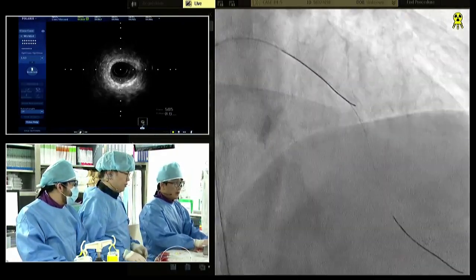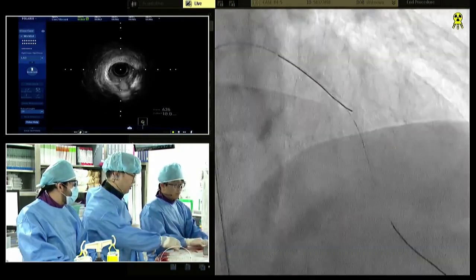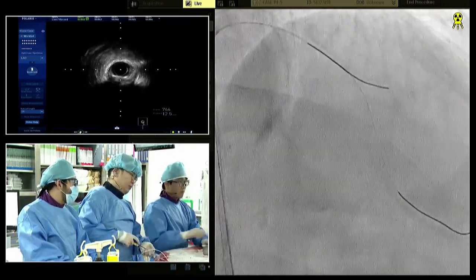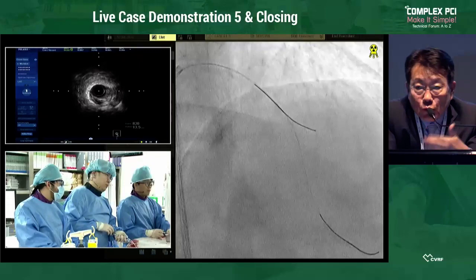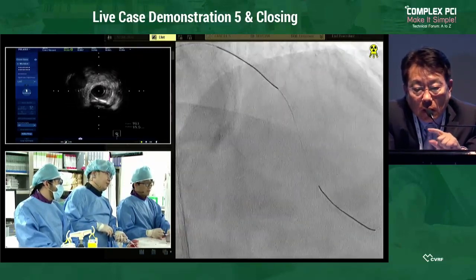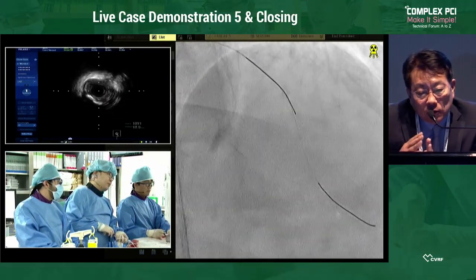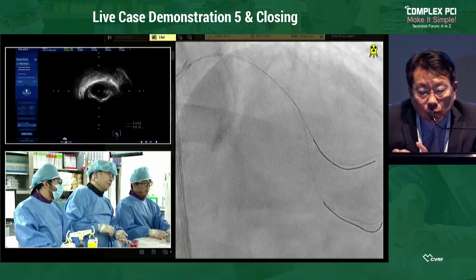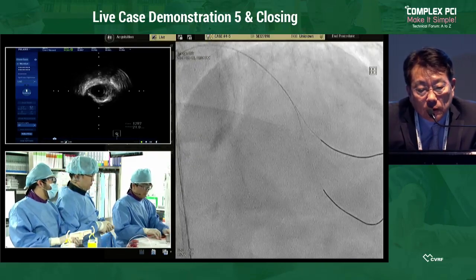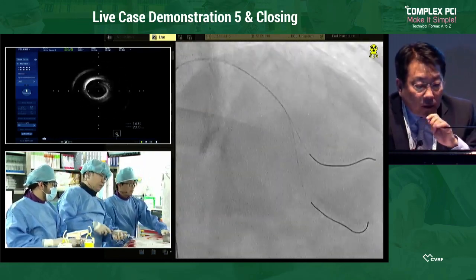Do you have any comments for this procedure, LAD? I think it's great. Just the two diagonal branches. You mentioned the angle, and angiographically it is quite good, the first and second diagonal. However, the second diagonal had a steep, narrow angle, so you have to protect that first, and the first diagonal would be okay for that, right? Okay, Dr. Lee, yes, it's great.